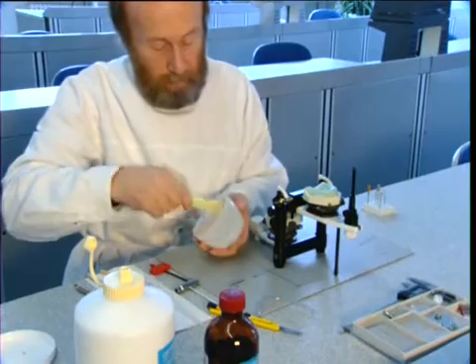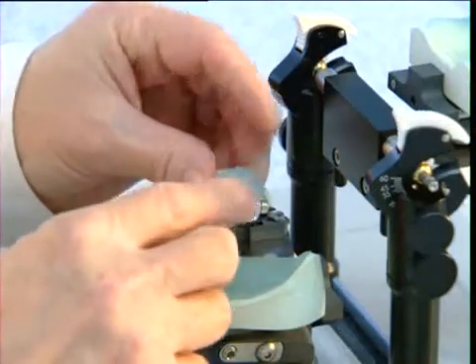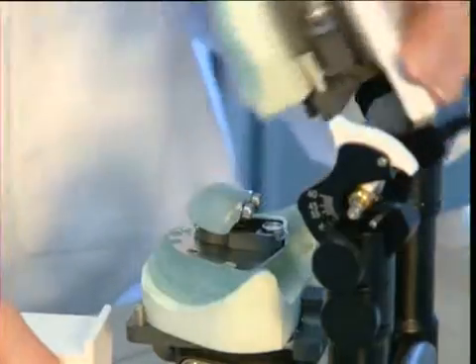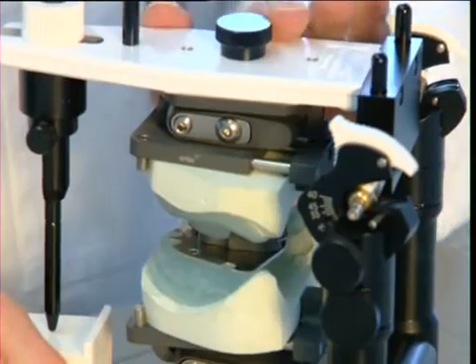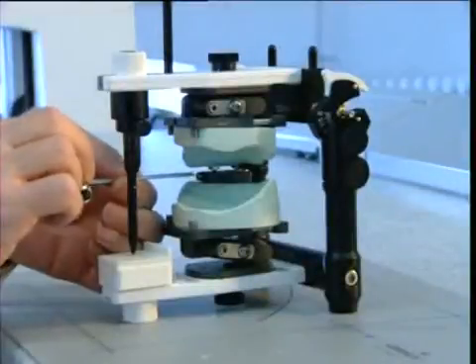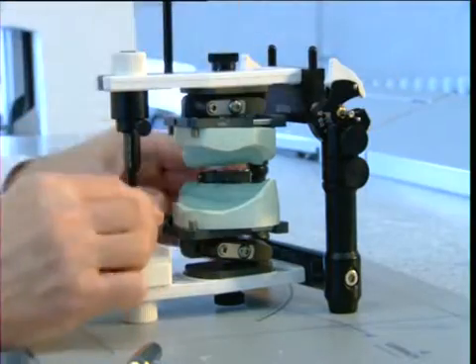Mix the tray material to a dough. Place it on the inside of the pin holder and moisten the palatal surface of the upper tray with monomer. Close the upper member of the articulator, invert the articulator and adapt the soft dough to the palate. Once the tray material has cured, loosen the locking screw and open the upper member of the articulator.